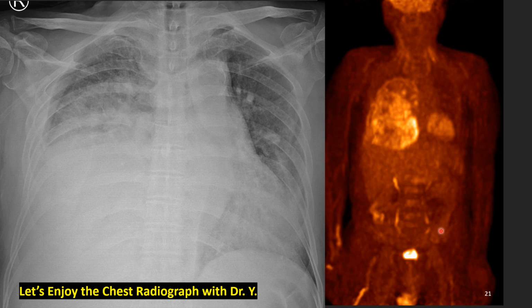How about this PET CT image? These hot areas are all glittering gold of small cell lung cancer. And this line of hot uptake usually means diffuse pleural malignancy, pleural metastasis. So this is an extensive big mass with pleural metastasis. There is no other hot uptake in other areas.